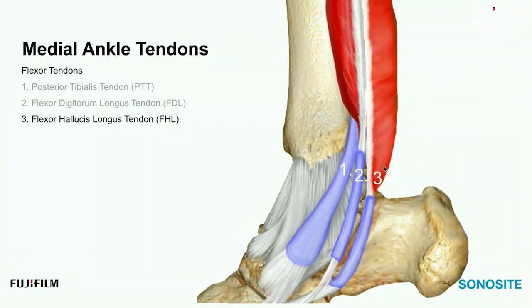Some overdevelopment might cause crowding, tenosynovitis, swelling, and ganglions may also cause crowding in this area. So you can end up with some FHL tendon sheath issues, as it has its own tunnel here, and we'll show that on one of the slides. But flexor hallucis longus is this guy here. I didn't put this in the slide and I should, but a way to remember this from the medial or malleolar level and posterior would be Tom, Dick, and Harry. So that's one way people remember this.